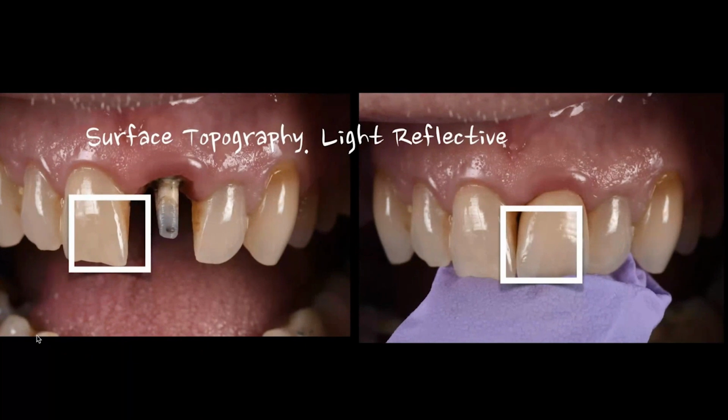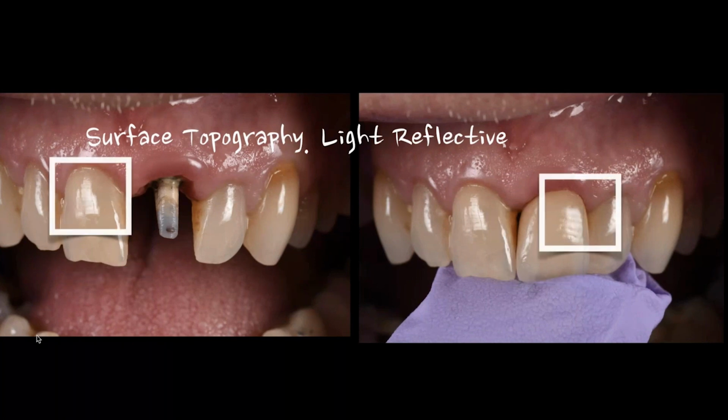Now, I would argue it's not perfect. My line angle should be a little sharper there. It should definitely have a little more reflective light, but it's that little tweak that helps it to harmonize and blend in with the adjacent tooth. Also take a look at this area here. Look at the area of the natural tooth that not only has surface topography, but also has some light reflectance, even from the angle that we're taking the photo. And it's my job to match that.